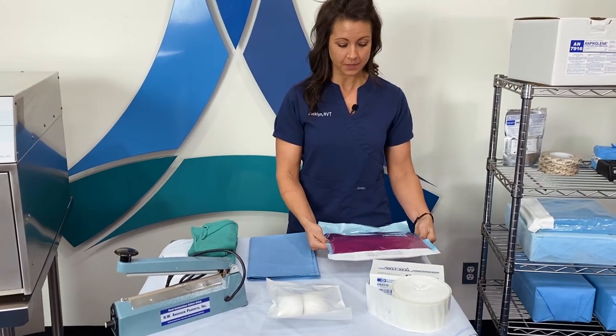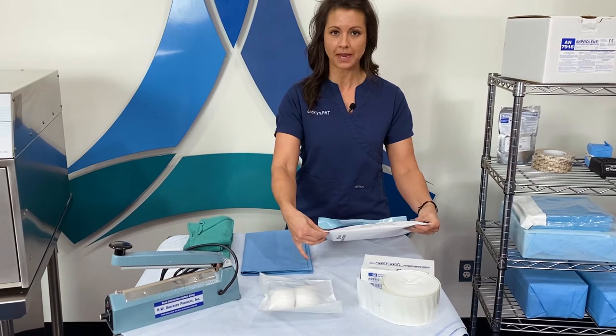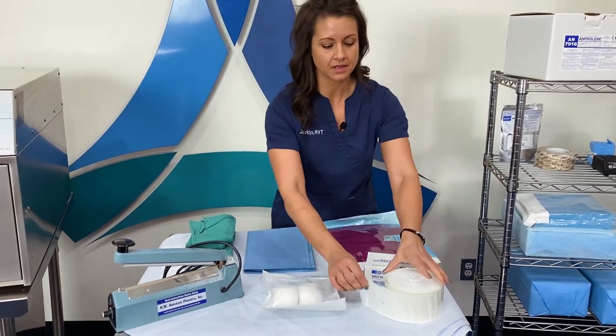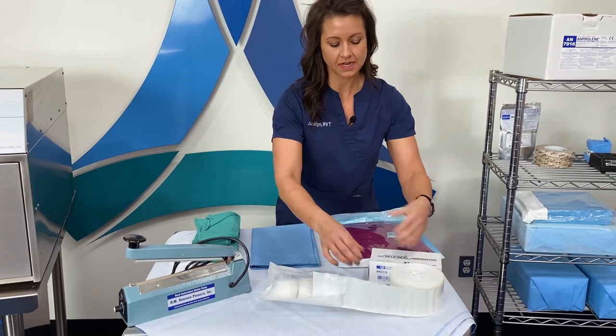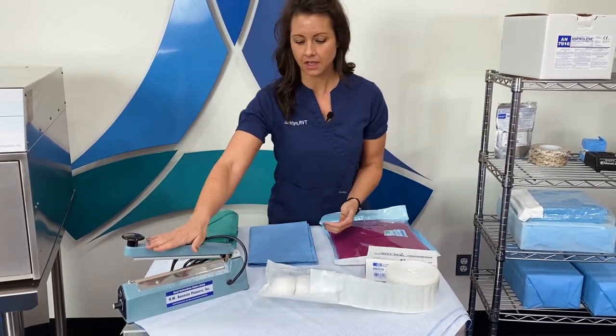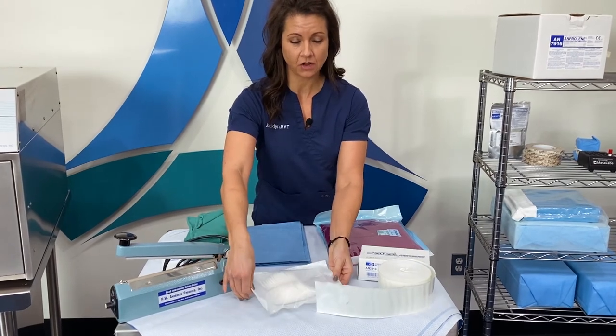Other sterile wrapping materials would be adhesive — this is a self-seal pouch. And then the heat-sealed pouches, which are custom to the size; they come in several different sizes, and then you heat seal these pouches. These greatly extend the shelf life.